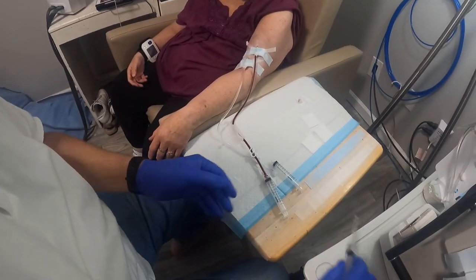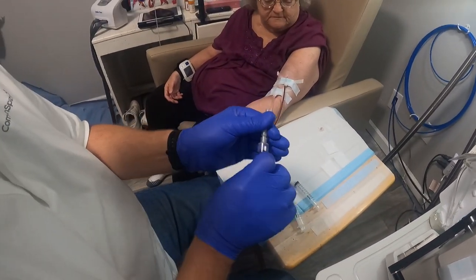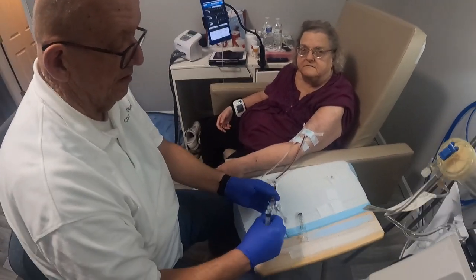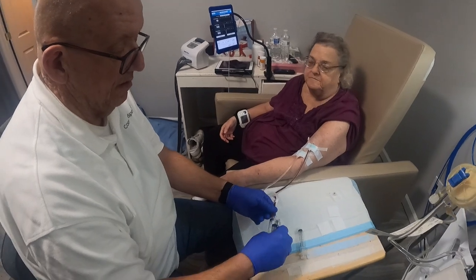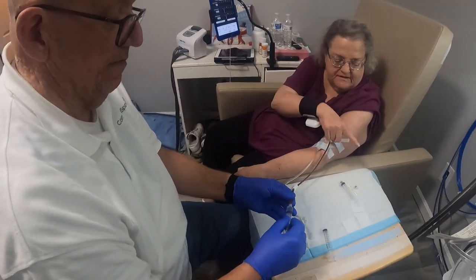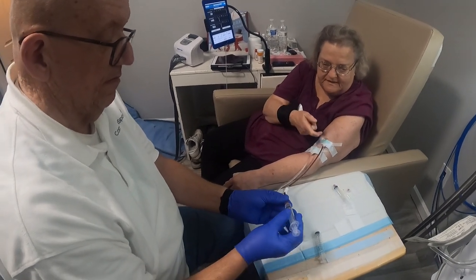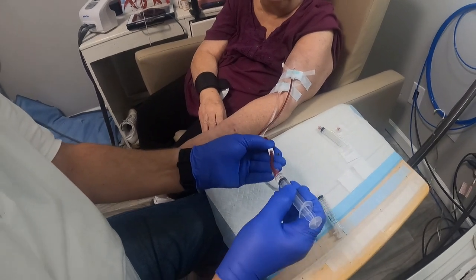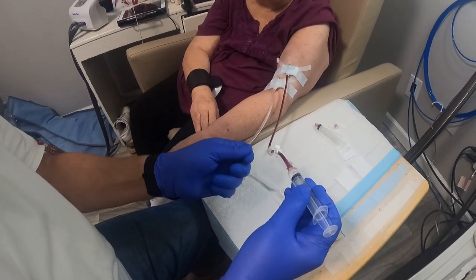And then we're going to go ahead and administer the heparin. You need to expect that it's going to be a different result every time, even if it's the same. Because sometimes we have to take gauze and put it up underneath the needle and get a little bit of a different angle on it. So there could be roadblocks every time. You'll see that process here in a minute.